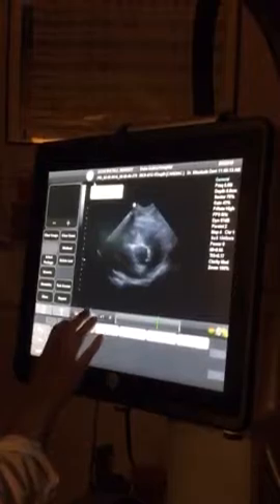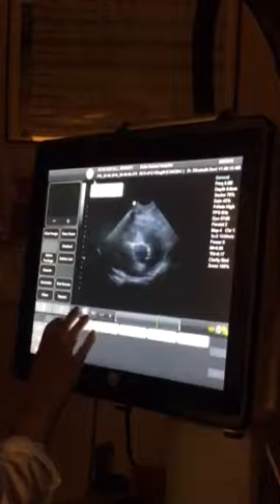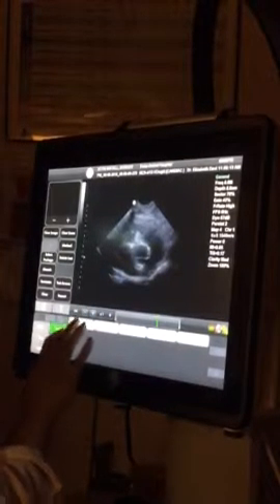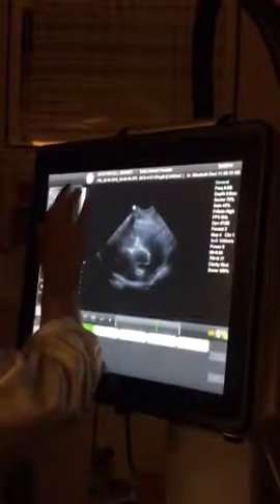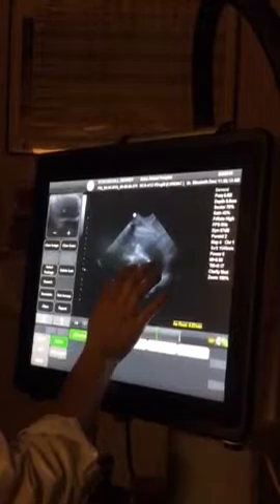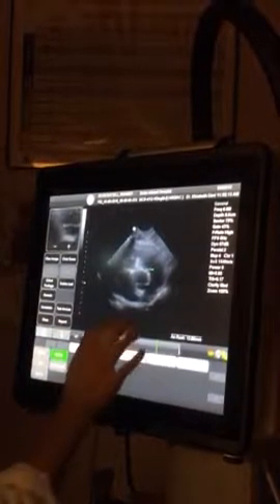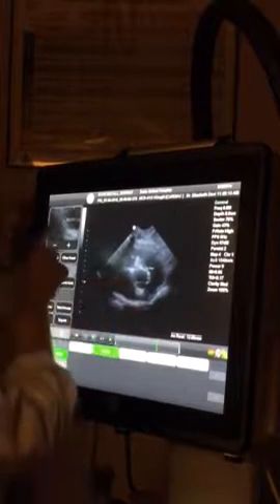Here you go, that's pretty nice. So you want to go aortic root first. You go enter to enter. That caliper kisses up next to the other. If you need to make adjustments, you can make it from there.